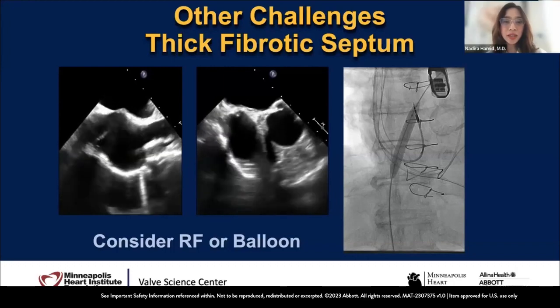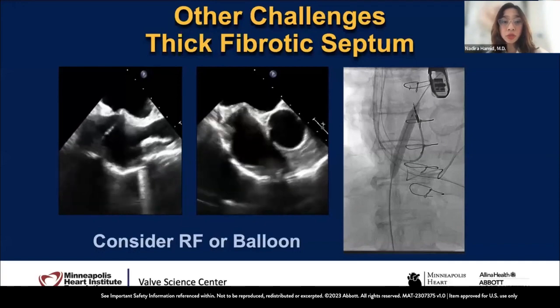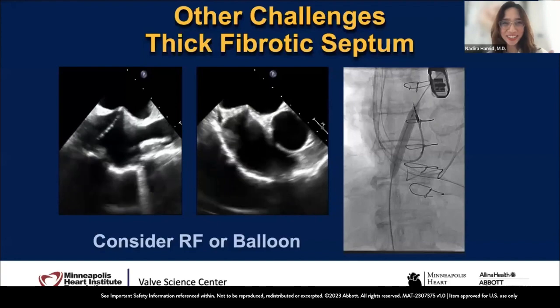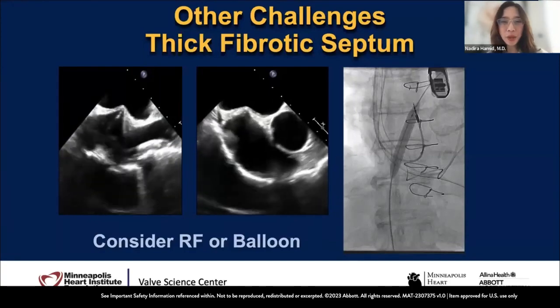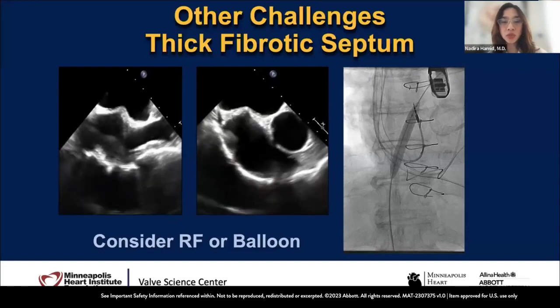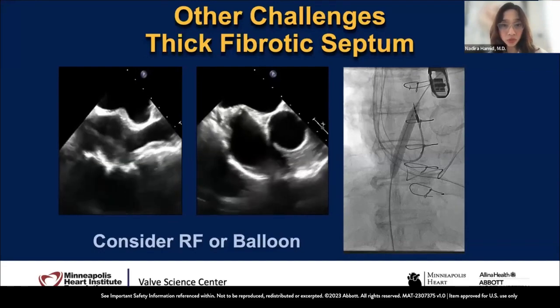Usually we do that. And Ryan, when they balloon, we imagers will watch it as well. Absolutely, watch the balloon. Don't stop imaging. It's continuous imaging, whatever he does. And he can also see as well. Ryan will see a screen on his console to make sure that it's absolutely safe.